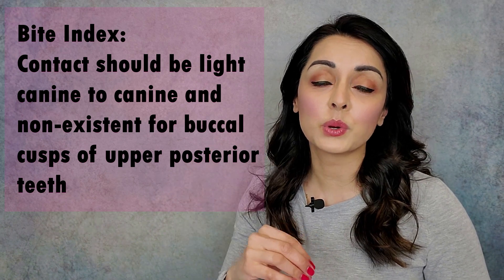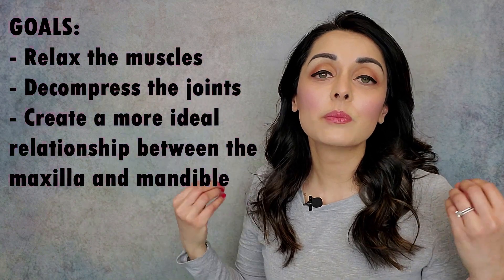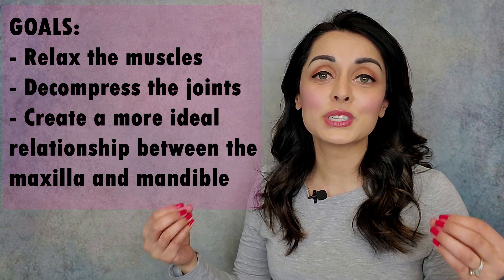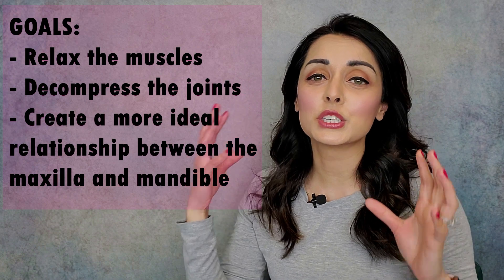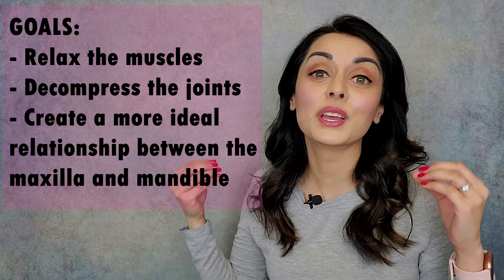You want them pretty light canine to canine, and you want almost no contact for the upper posterior teeth — the buccal cusps of those. The lingual cusps you definitely want contact; the buccal cusps not so much. The reason for that is if all four of the molar cusps or the buccal cusps of the premolars are hitting against the occlusal guard, it gives the patient more to ledge against, to grasp against, and to grind their teeth against. Sometimes when they find something to ledge against, it can actually temporarily worsen symptoms. So keep those buccal contacts pretty light or non-existent in the back and very light in the front with the incisal contacts.